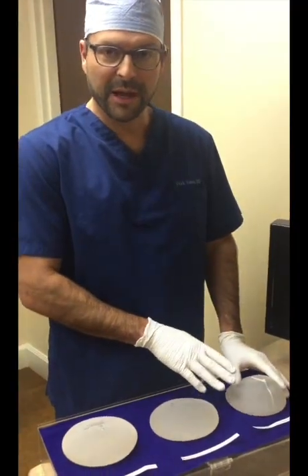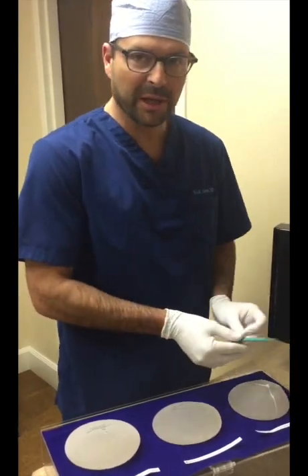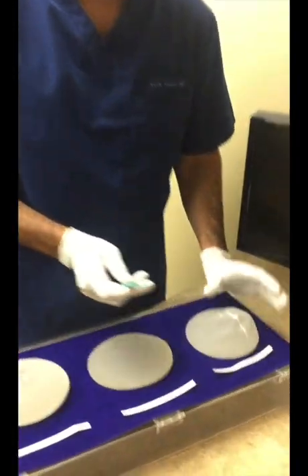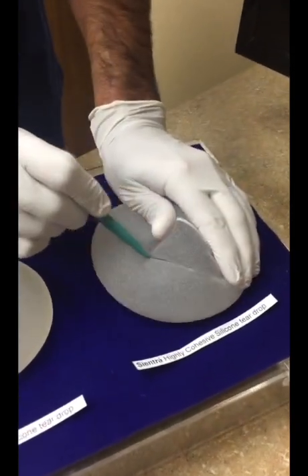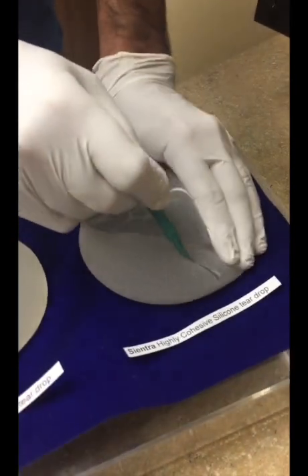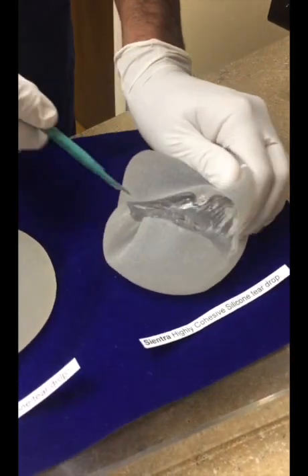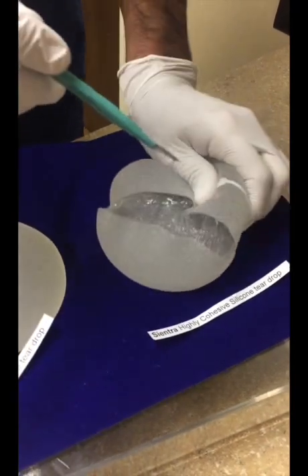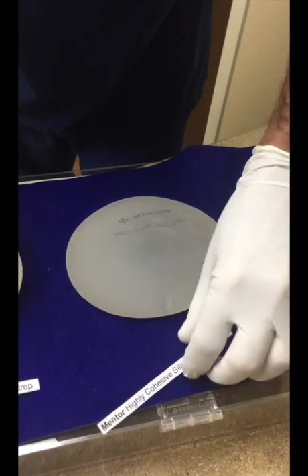Now we're going to test with gummy bear implants, or teardrop-shaped implants — how they respond to being cut in half and what the silicone does. Here's a Sientra implant. I'm going to take a big cut through this, all the way through, to see if we can cut through that entire shell. That's worse than you would ever get from a tear on an implant naturally in the body.